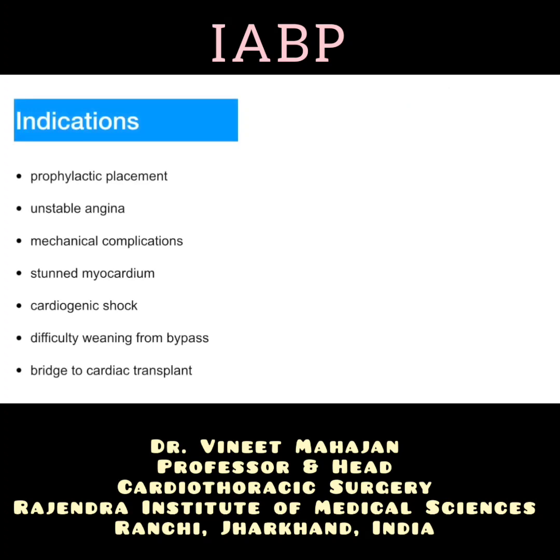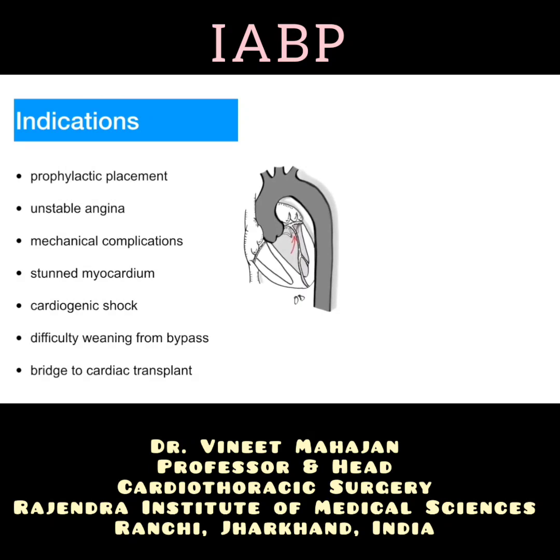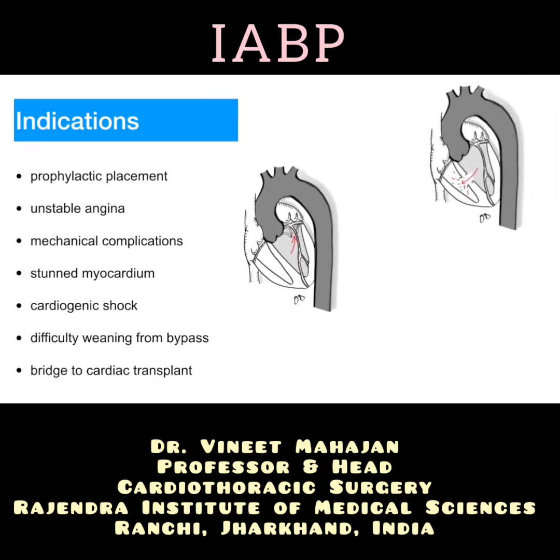There are a variety of indications for the use of the intra-aortic balloon pump. Prophylactic placement for high-risk patients with critical coronary disease, usually the left main. Unstable angina refractory to medicinal treatment options, or hemodynamic compromise prior to urgent therapy. Mechanical complications of myocardial infarction, such as acute mitral regurgitation or ventricular septal rupture. Stunned myocardium. In cardiogenic shock to allow for unloading.